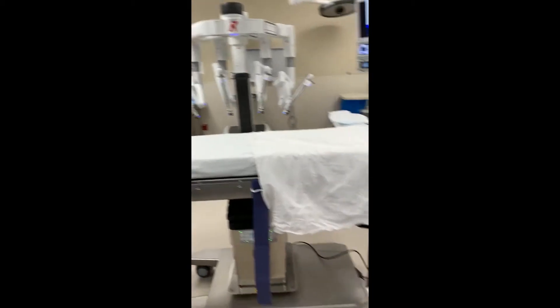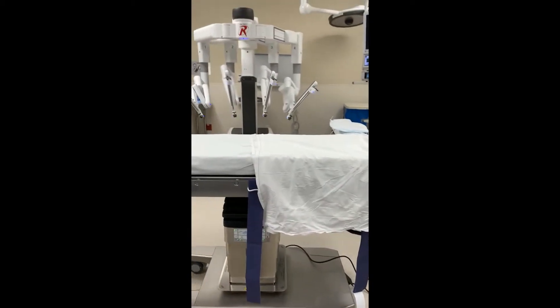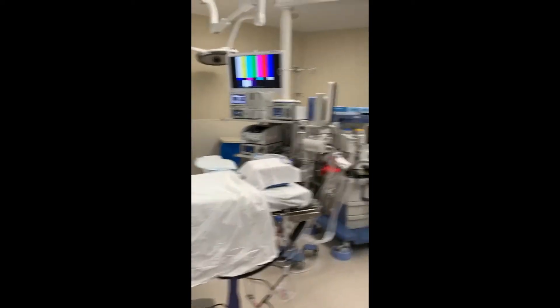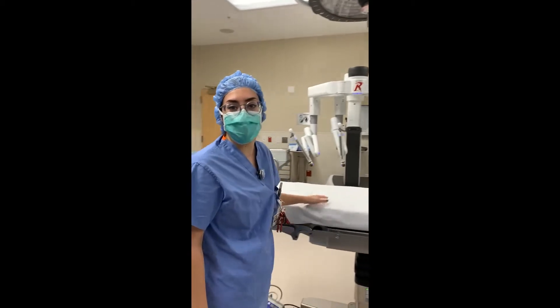The patient bed that we use is hooked up to the robot itself, so you can position the patient or move the table in any way. It all works together so you don't have to worry about how the instruments are going to interact with the patient tissue.